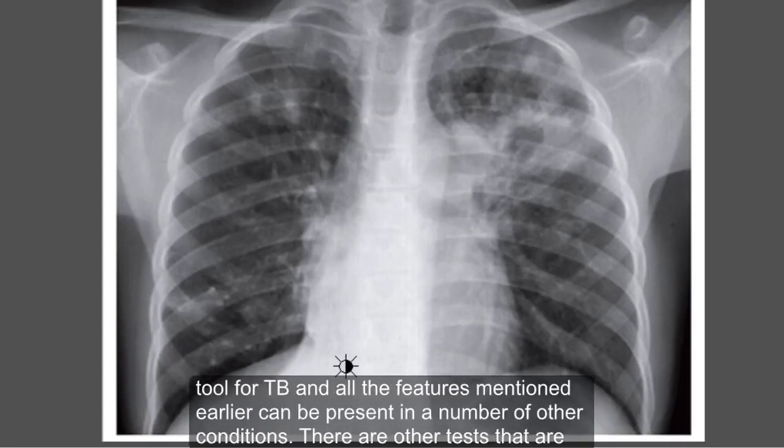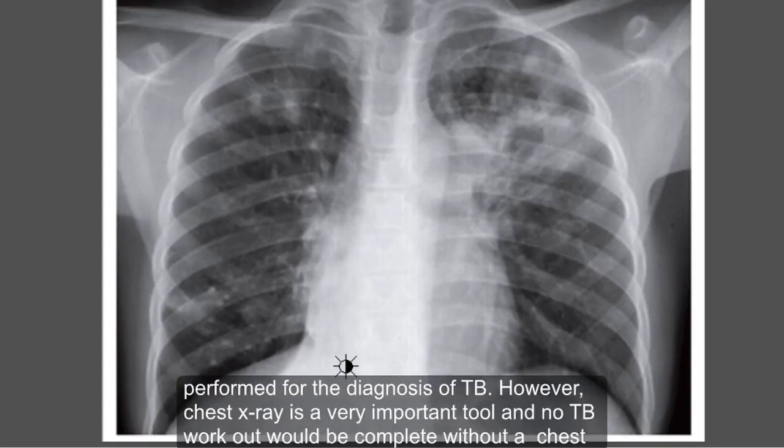Chest X-ray is not always the best diagnostic tool for TB, and all the features mentioned earlier can be present in a number of other conditions. There are other tests that are performed for the diagnosis of TB. However, chest X-ray is a very important tool, and no TB workup would be complete without it.